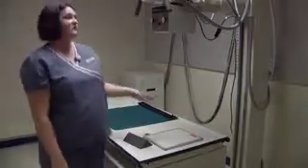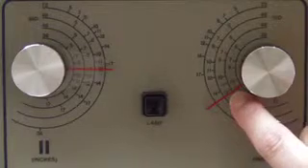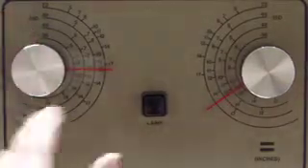We're using a 10 by 12 cassette, so you're going to go to 40 inches SID on your collimator and collimate to 10 by 12. This would be your cassette size.